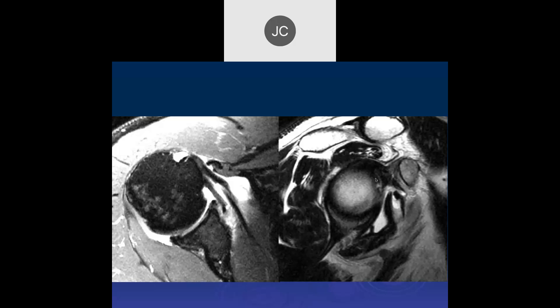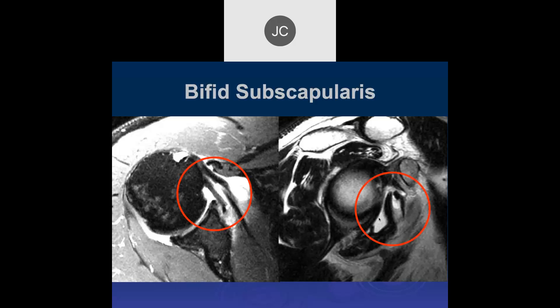There's something wrong with the subscapularis — the myotendinous junction is retracted, involving the upper third of the subscapularis fibers. It looks like there are two tendons there, and this was a bifid subscapularis tendon, which is quite rare.